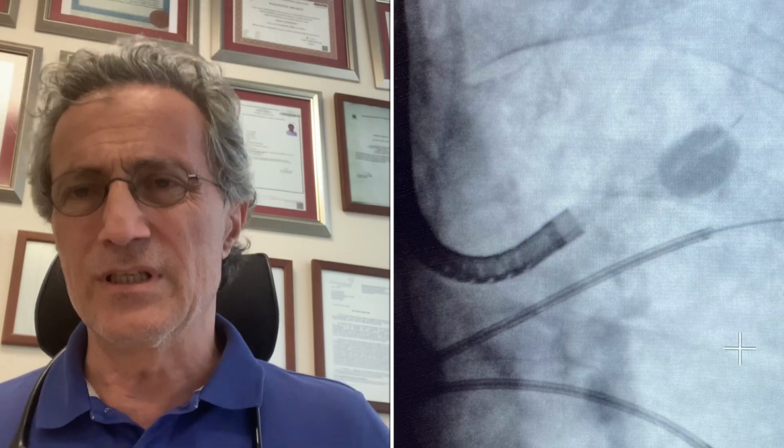Patients are consulted with anesthesia to determine if general anesthesia is needed and if there is any risky situation, and this could be detected as well. And we medicate with Ventolin, and a breathing test is performed to determine the patient's final stage of COPD.